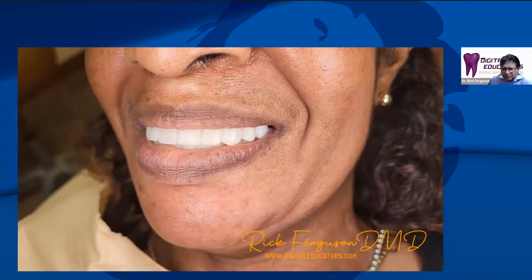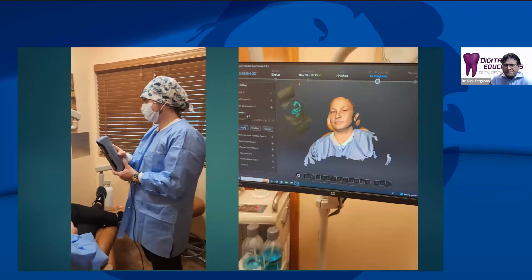And then you also have either printing or milling. We're printing in a variety of different resins. In this case, with the PacDent resin. But when we mill in zirconia, we're also using the Rosen screw technique and going directly to multi-unit. There are some parameters you have to keep in mind as far as minimum thicknesses and such, but we've had really good success with that as well.